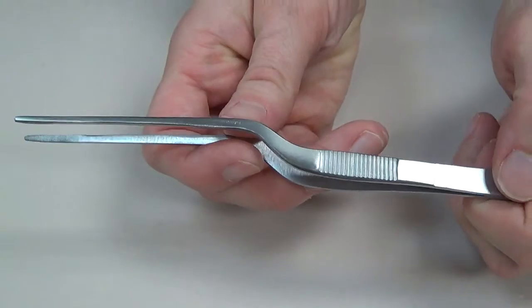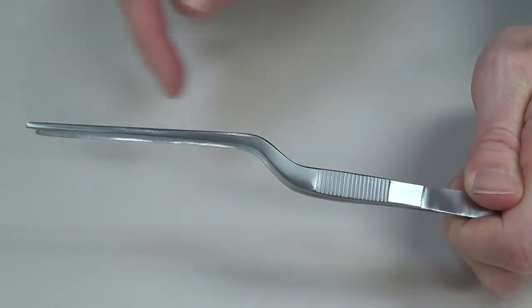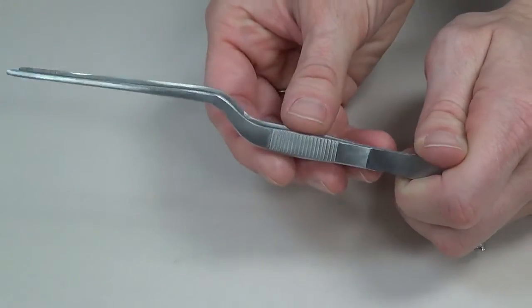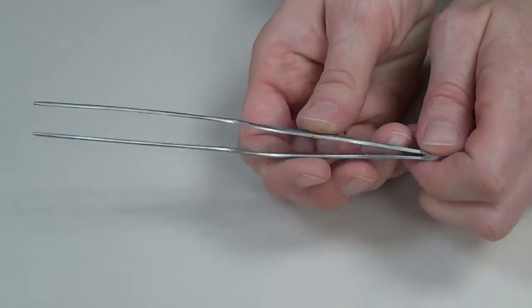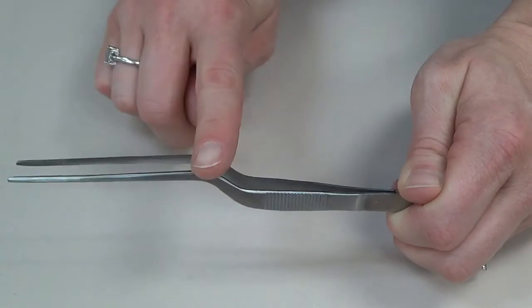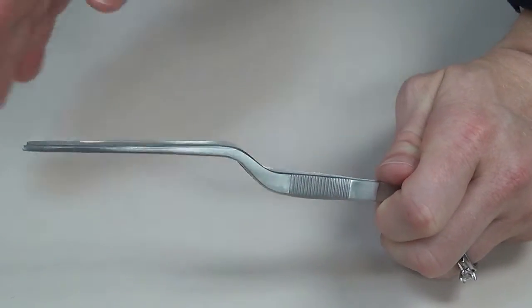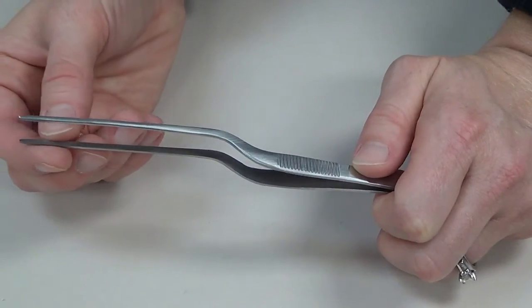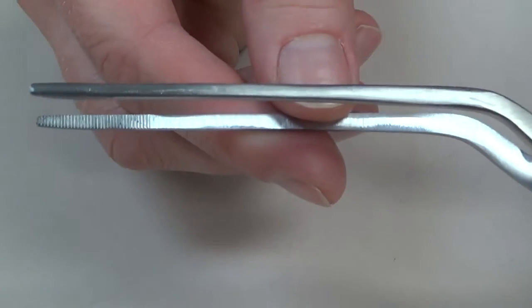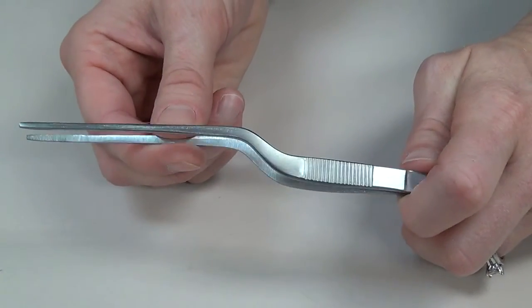Our last forcep is the bayonet forcep, which comes in two lengths. It has a hump in it — the purpose of which is to move the surgeon's hand out of the way so they can look down the tip of the instrument into the wound. We always hand it with the hump up, so they're looking down the barrel like a bayonet attached to a gun. We use this to place cottonoids into the wound and in the nasal cavity to get into deep, narrow spaces for grabbing tissue or placing sponges. There are no teeth — it's an atraumatic forcep because it contacts structures such as the dura, brain, or nerves, and is very commonly utilized during neurosurgical procedures.